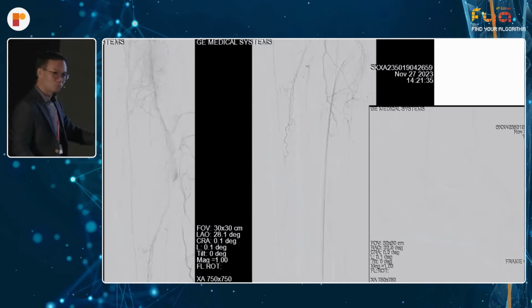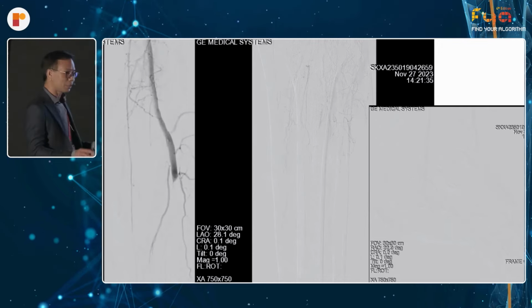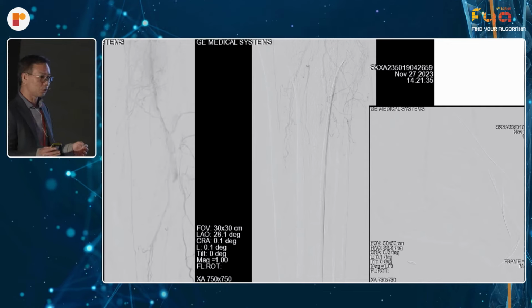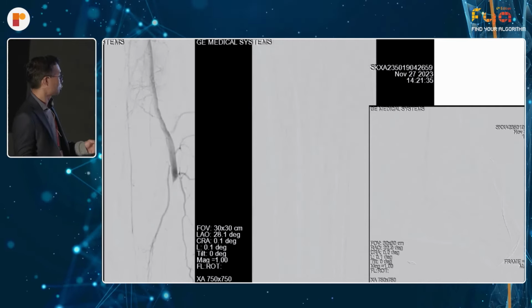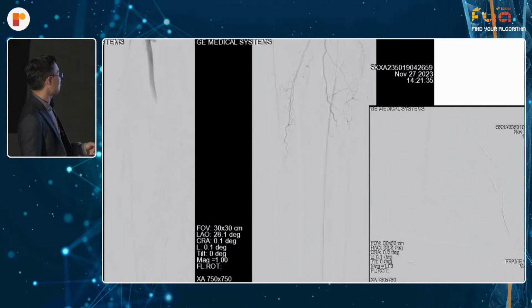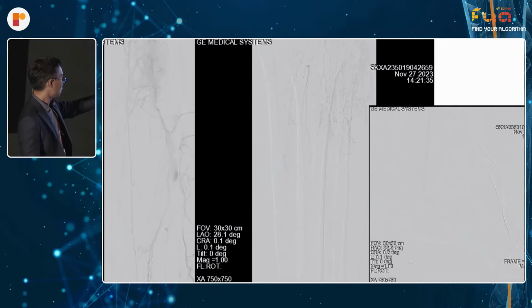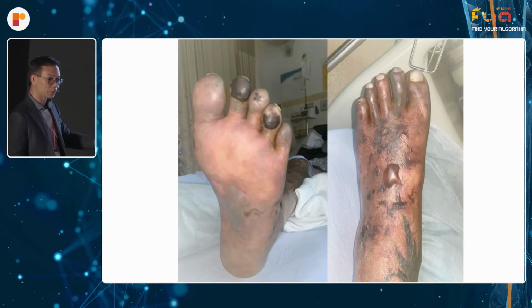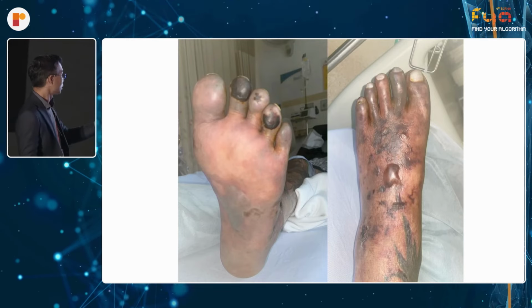Okay. So again, this was one of my great saves, and this was only about 3 months ago. This is really using the, one of my fellows used the pedal plantar approach in order to save this chap's foot. This is acute limb ischemia. You can see the sudden cut off there, nothing to the foot at all. The foot is in a bad shape. This is a young gentleman in his 50s, in serious trouble.